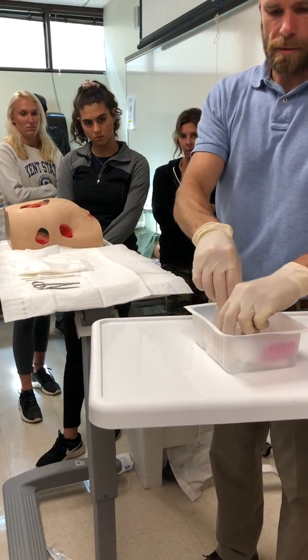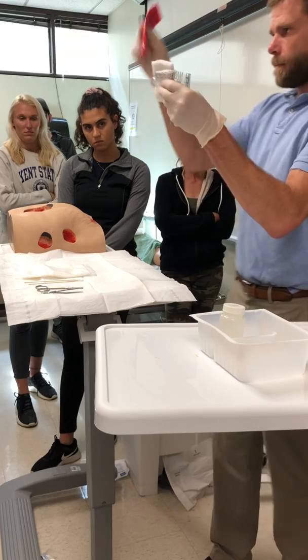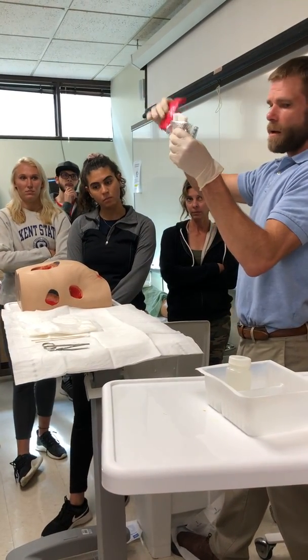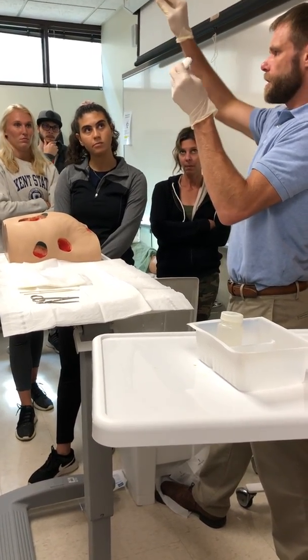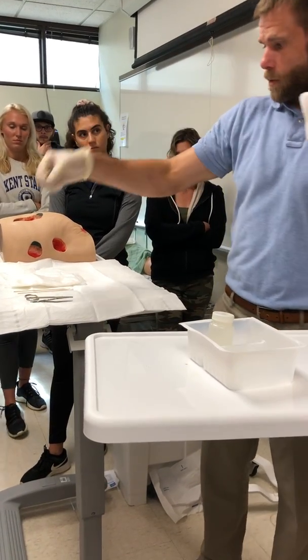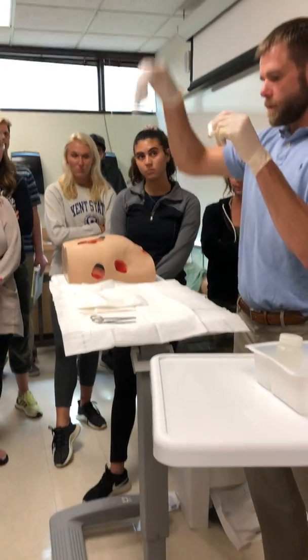Tape to tape, nothing. That's if I had taken off the whole dressing. I might have had it bundled up on chucks or something, and I could throw it all in there. I don't need to do that. I don't need to measure. I already measured. 4x4s.